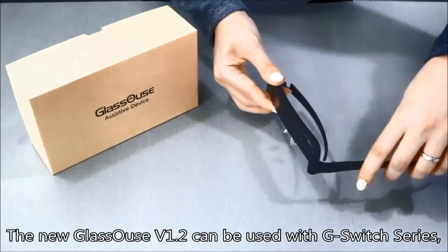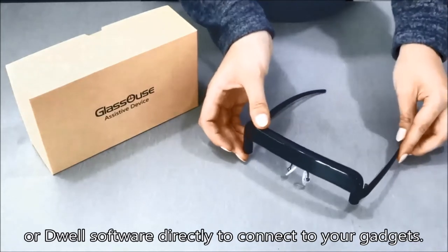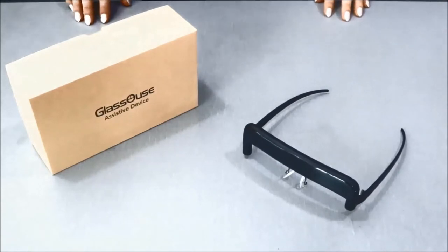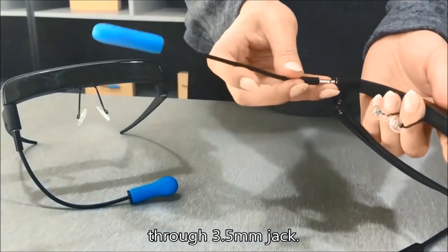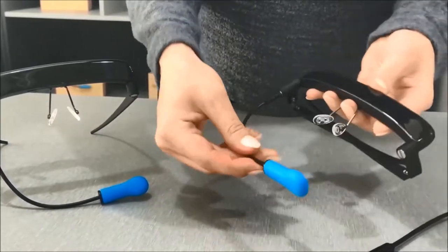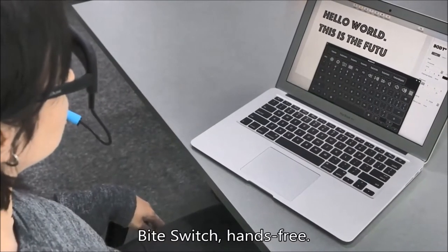The new GlassOuse version 1.2 can be used with G-Switch series or dwell software directly to connect to your gadgets. You can connect Bite Switch to GlassOuse through the 3.5 mm jack — simply plug it in and adjust the wire. You can do the clicks by biting the switch module of Bite Switch, hands free.